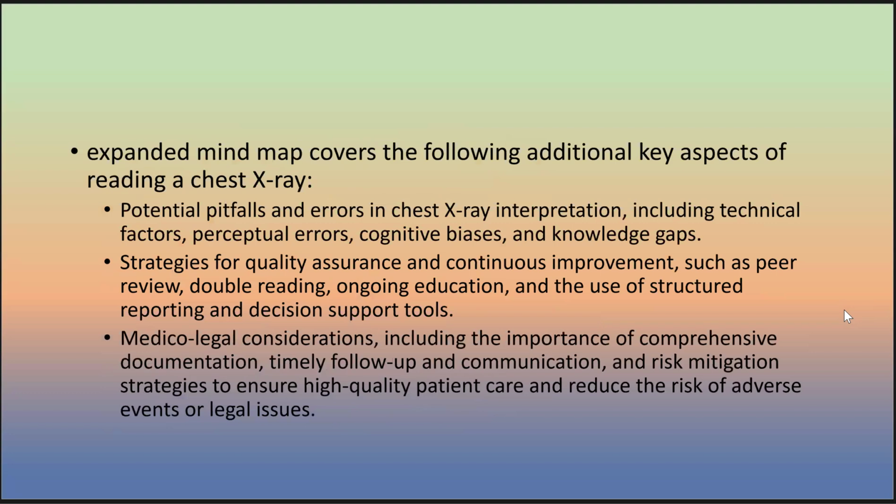This expanded mind map covers the following additional key aspects of reading the chest X-ray. Potential pitfalls and errors in chest X-ray interpretation include technical factors, perceptual errors, cognitive bias, and knowledge gaps.